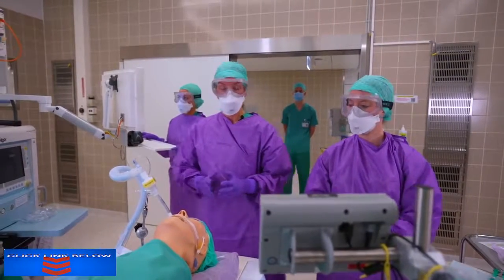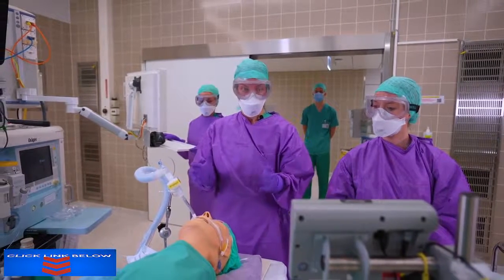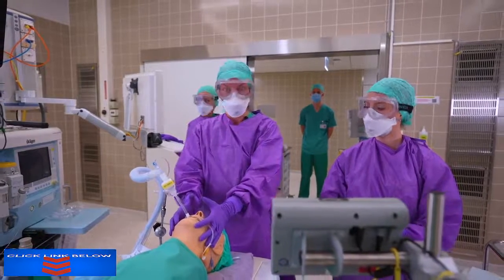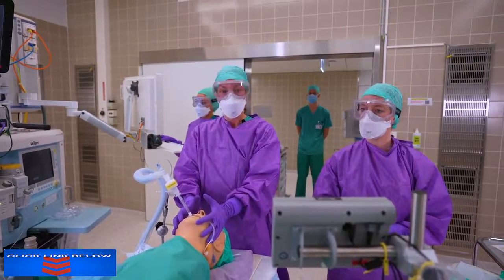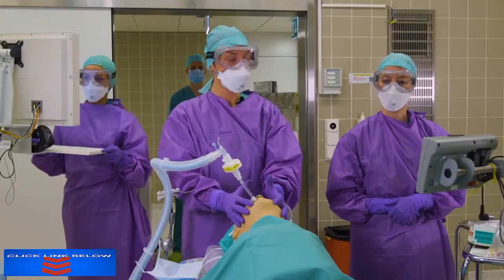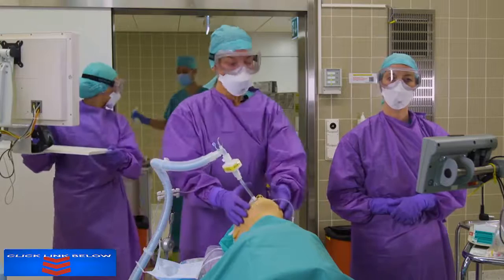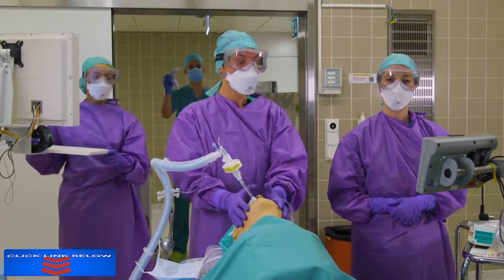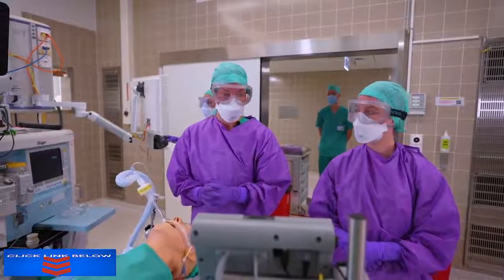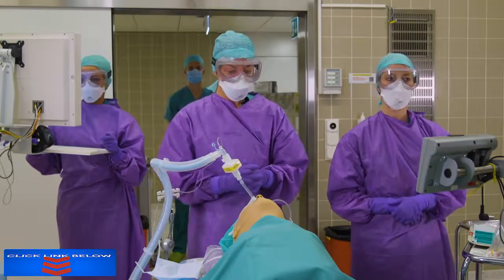If a patient is desaturating and you have to bag-mask the patient, it is very important to use both hands to bag-mask the patient to have a tight seal and have a second person, Larissa in this case, to bag the patient. If the bag-masking is not successful, it is important to then reach out to the person outside the room and gather other aids. For example, LMA. If you have to escalate to a fiber optic scope, please use a single-use fiber scope.